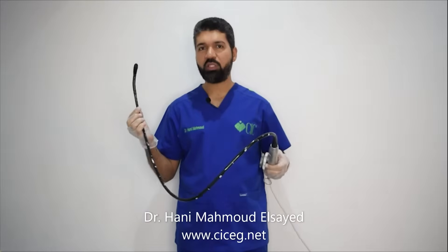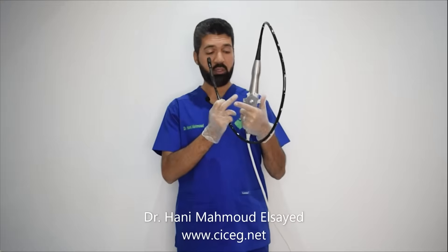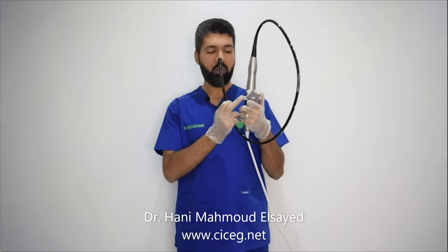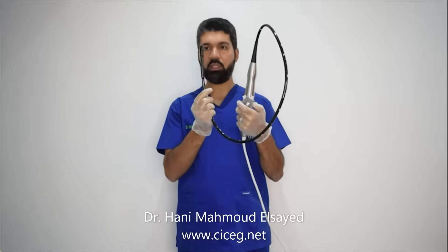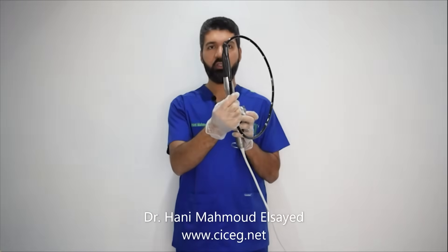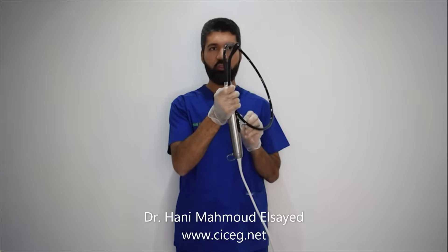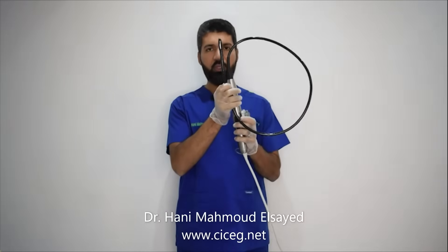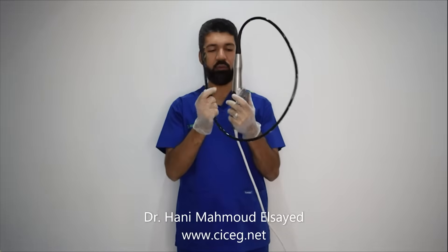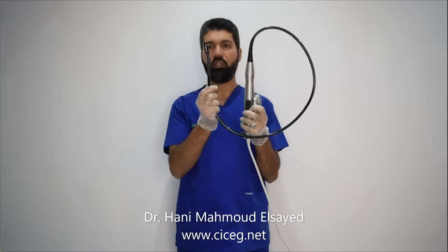All vendors have the same components of the transesophageal probe. This hand part has the wheels — the small wheel, the big wheel, and the knobs. The small wheel is responsible for lateral flexion; if you move it from side to side, you can see the tip move side to side. I rarely use it. The big wheel is the most commonly used one and is responsible for anteflexion and retroflexion.